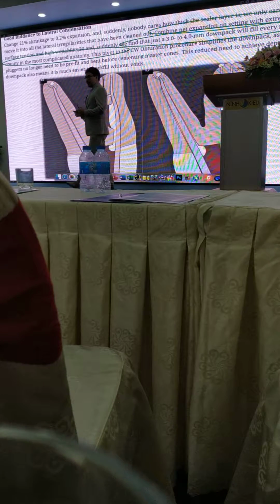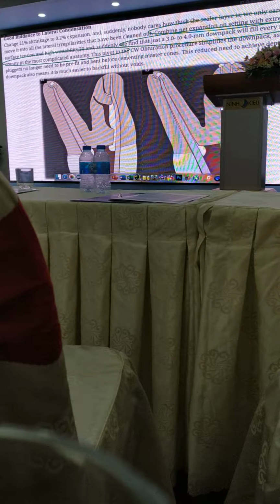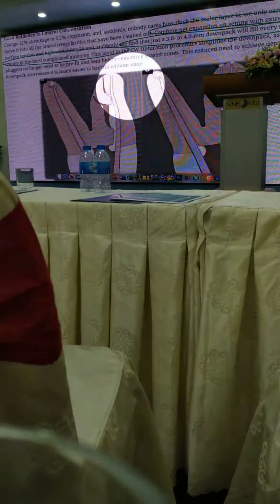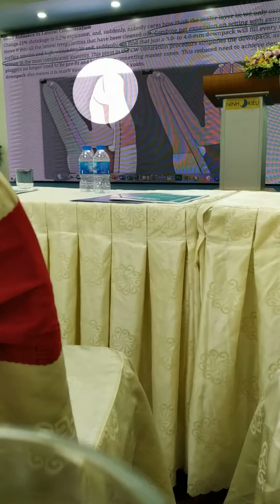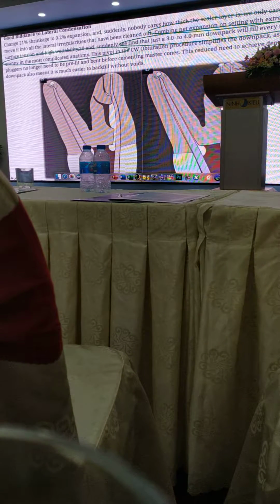In that way, we will be able to create a higher hydraulic pressure. We will pack the master cone in this area, and at the same time, we will be able to push the bioceramic sealer in all the ramifications. What to do after?